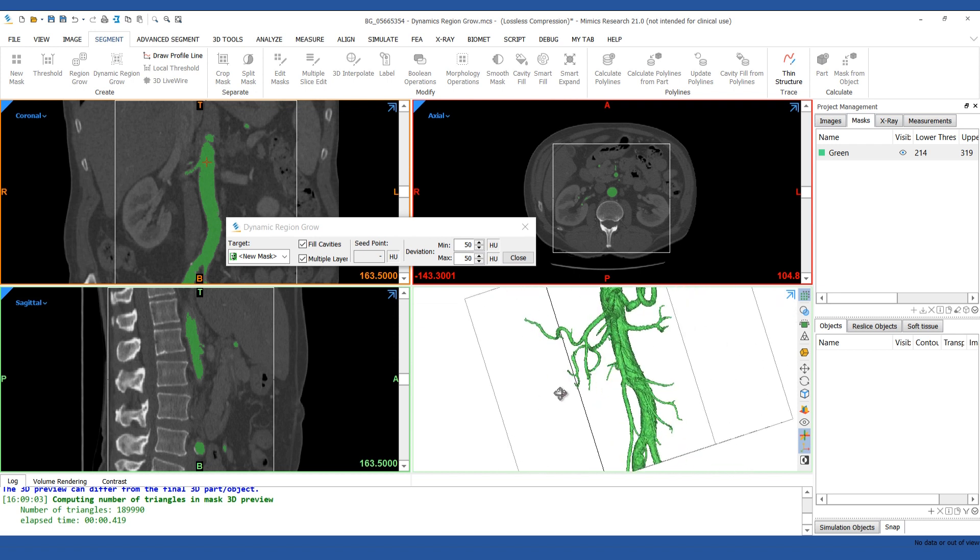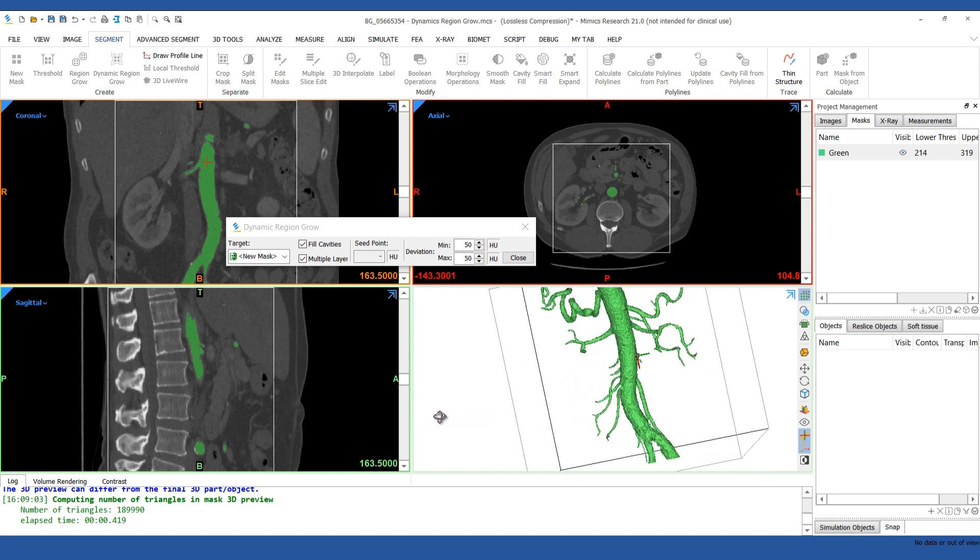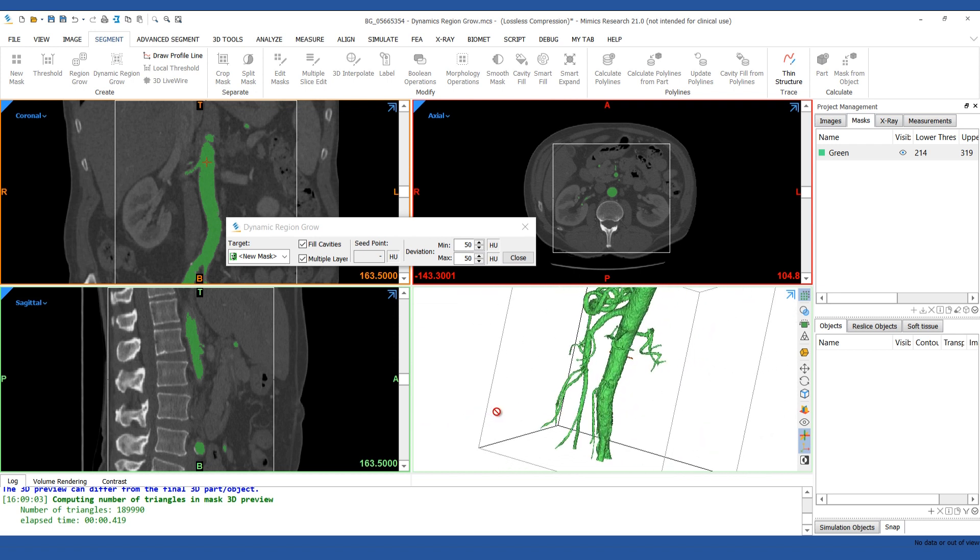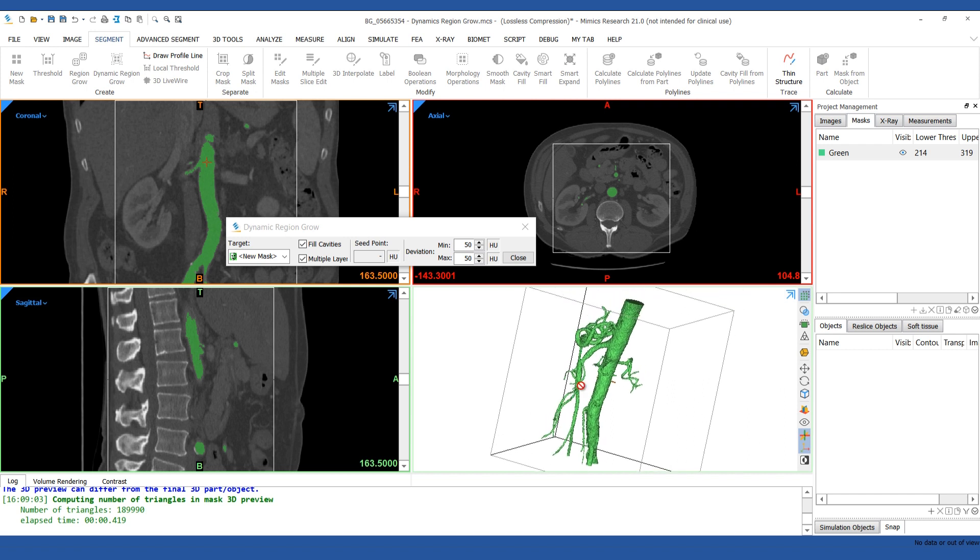You can change the deviation of the intensity value either before or after the effects. If you decrease it, it may not grow out quite as far.